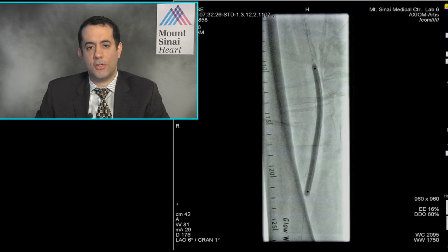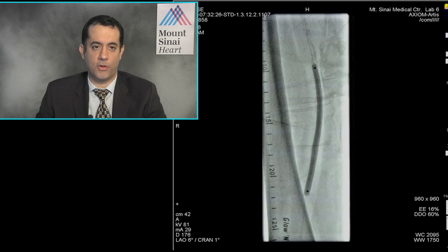Let me add, there's also one more thing. Remember at VIVA, there was a talk about preparing the lesion before we go to the DCB. What's your thought process on how we prepare a lesion when we put a stent in, more so in the coronary and the peripheral? But in your case, do you prepare the lesion with a PT or a plain balloon angioplasty before you deploy the DCB? Does it change the absorption of the drug if it's better prepared with the pre-dilatation, or just directly go for DCB? What's your thought on that?